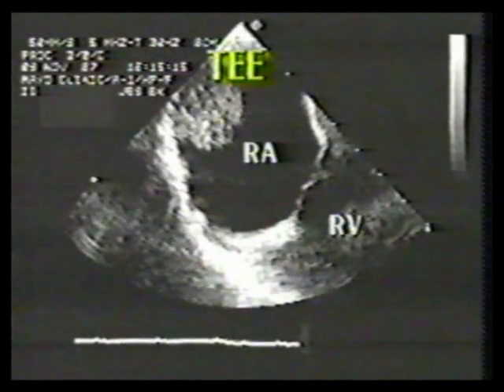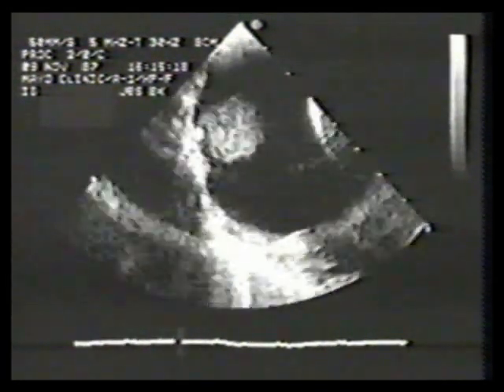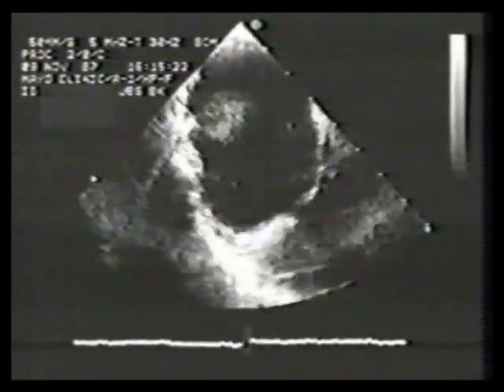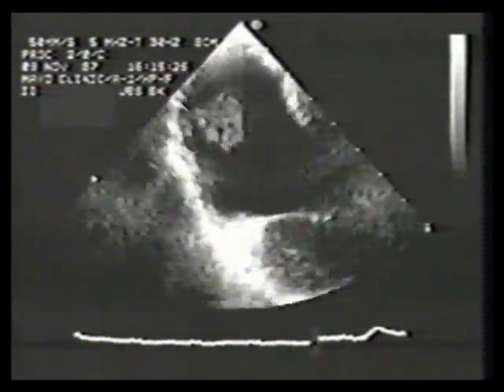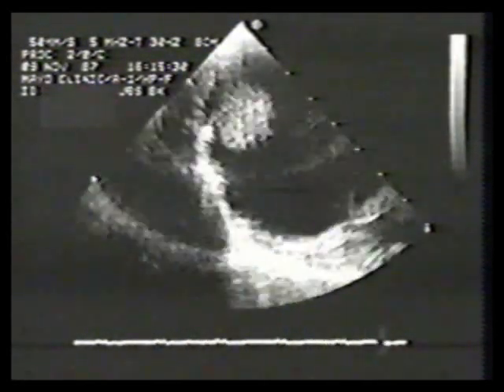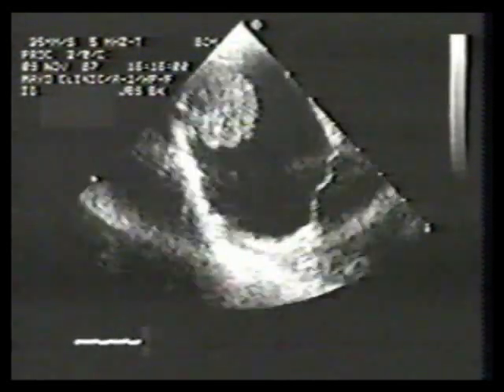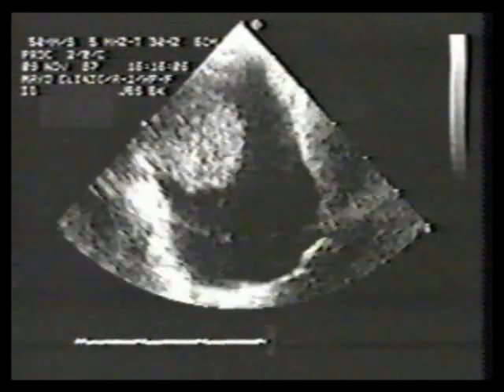On the transesophageal echocardiographic examination, the transducer is within the esophagus and adjacent to the right atrial cavity. Note that there is a small pedunculated ovoid mass in the free wall of the right atrium. This is an atypical insertion point for an atrial myxoma, but very much consistent with the atypical recurrent nature of the syndrome myxoma. This particular patient has had 7 recurrent atrial myxomas and has required 3 thoracotomies.